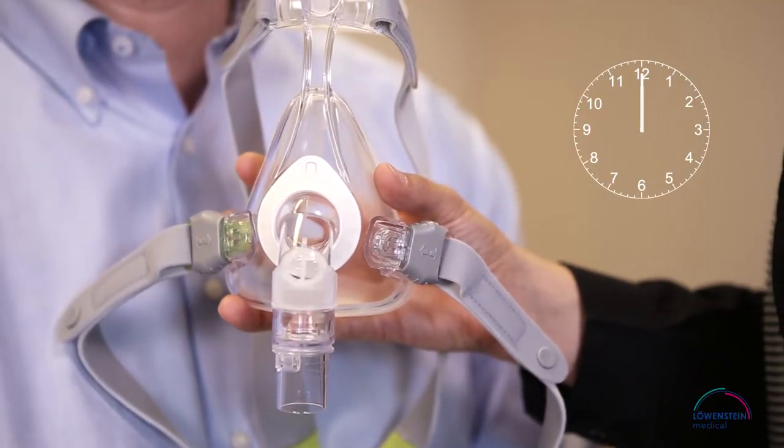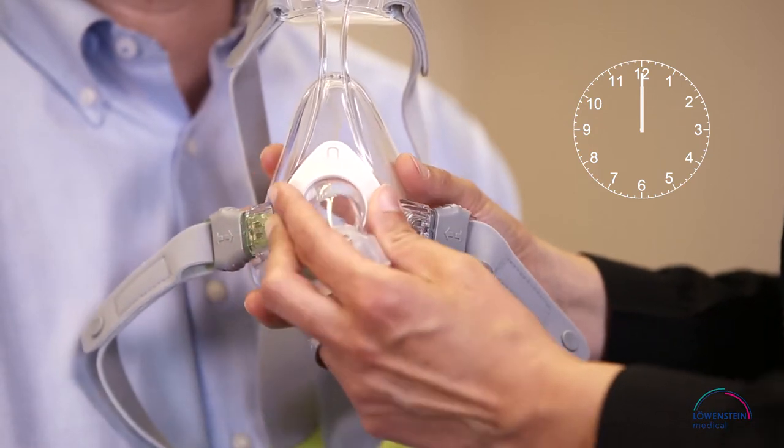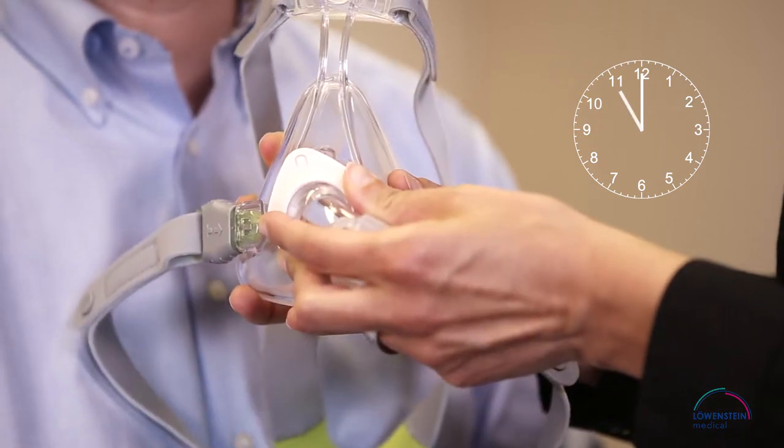To make a mask fitting, first remove the elbow from the mask. Imagine the retaining ring is a clock with the tip of the ring at 12 o'clock. Turn it to 11 o'clock and lift the elbow to remove.